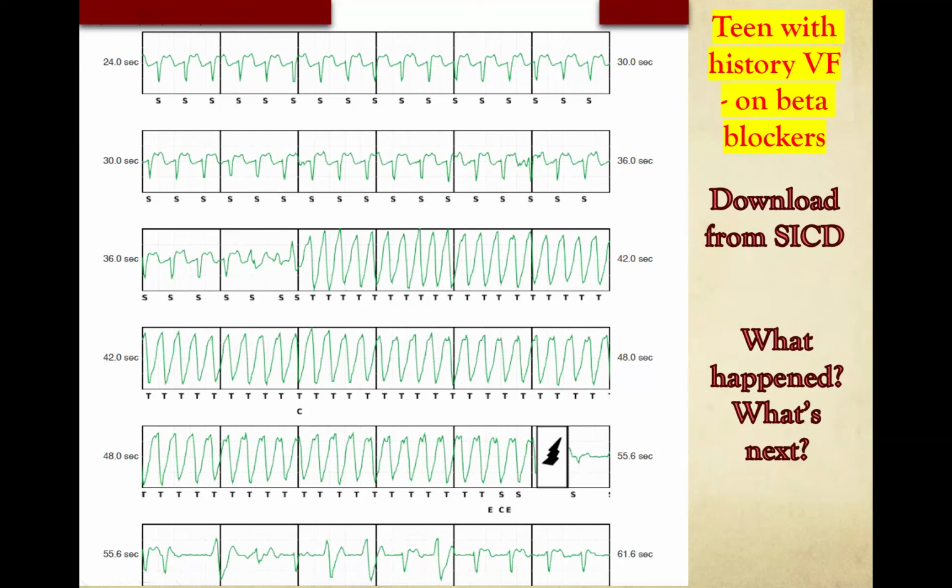We basically measure the so-called R wave. We induce something. If it senses it and shocks them out, we're happy about it. But we don't really know for sure if clinically that'll be the scenario. I've had the experience of 1 or 2 patients where the R wave was large. The sensing seemed to be excellent, even during testing in the cath lab or the OR, sensing was excellent during a defibrillation threshold test, but then they had a clinical arrhythmia and the device was incapable of seeing the arrhythmia.